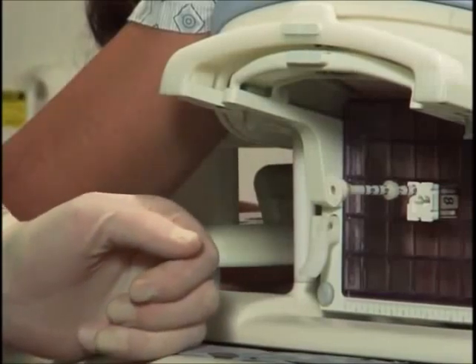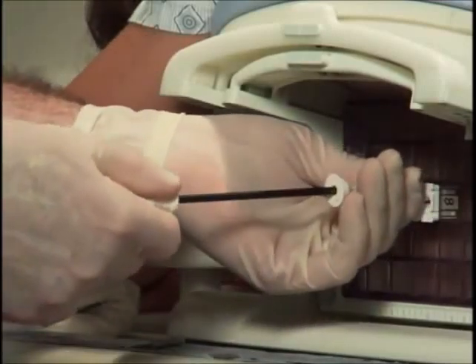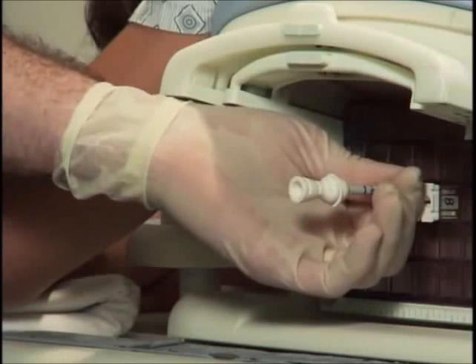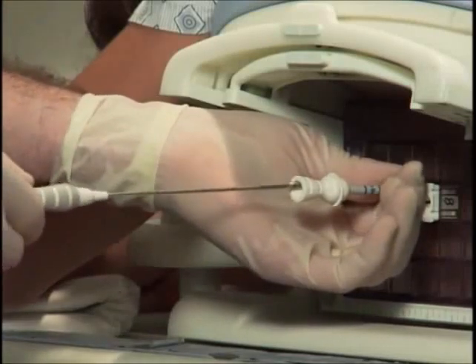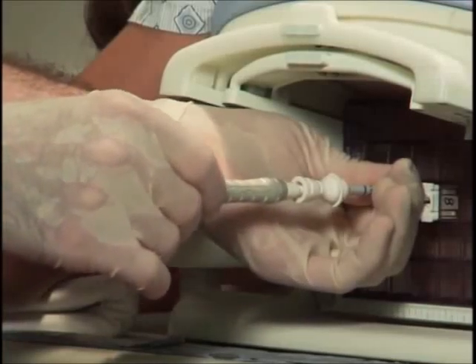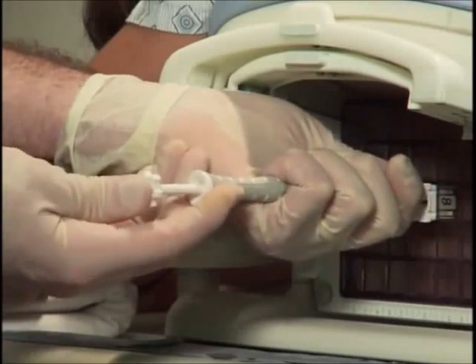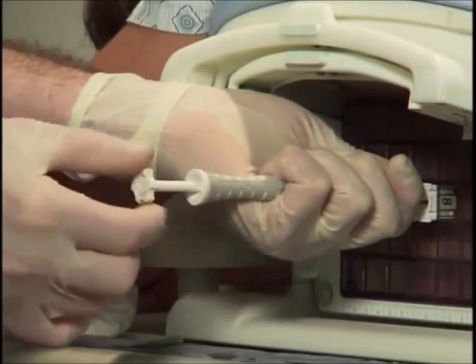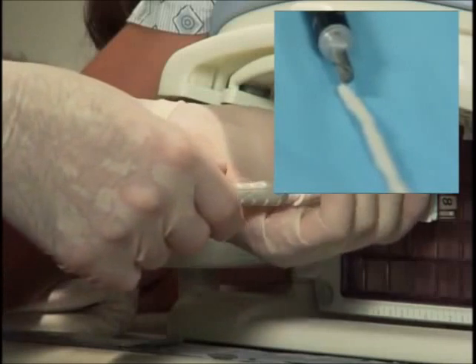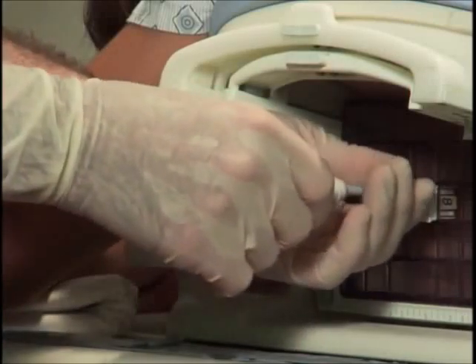Once you've completed your post-biopsy imaging and you're satisfied with adequate sampling of the lesion in question, return to the MRI suite and replace your obturator into the sheath, assuring not to move the sheath by locking your fingers. You will then deploy localization clips directly through the obturator. Introducing the deployment device, you will feel a pop and it will seat against the obturator. The deployment device is initially locked; by merely rotating the wheel clockwise, it will become disengaged and then you deploy the localization markers in the biopsy cavity. Once deployed, merely remove the device and your procedure is completed.